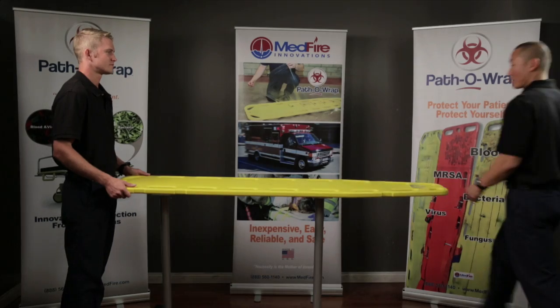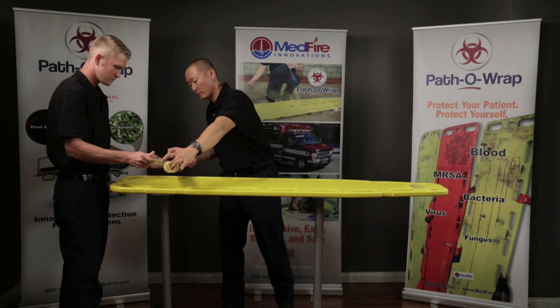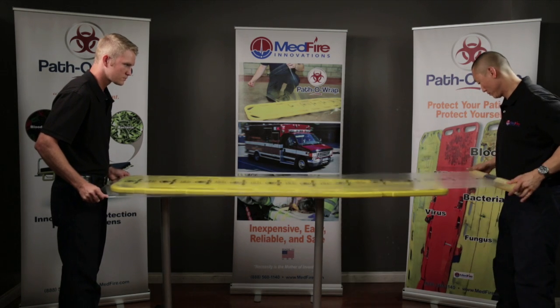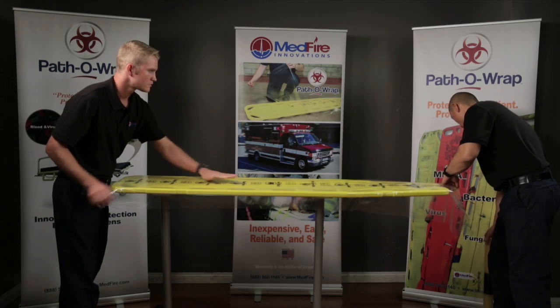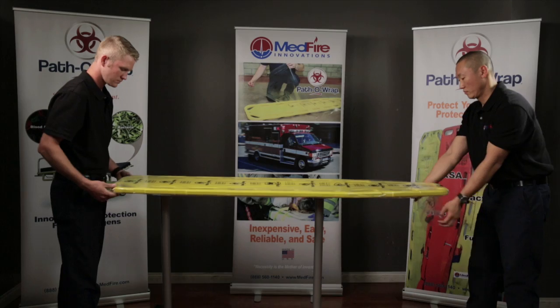To apply Pathorap to a backboard, pull from the leading perforated edge of a 20-count roll of Pathorap. Place the leading edge on one end of the backboard. Pull the roll of Pathorap film to the opposite end of the backboard, while simultaneously laying the Pathorap on top of the backboard. Smooth the Pathorap on the top and around the edges.